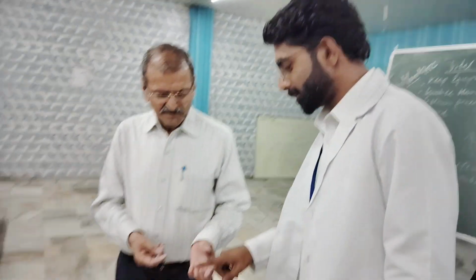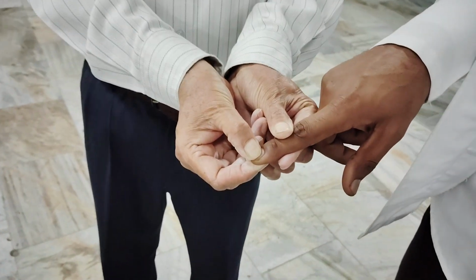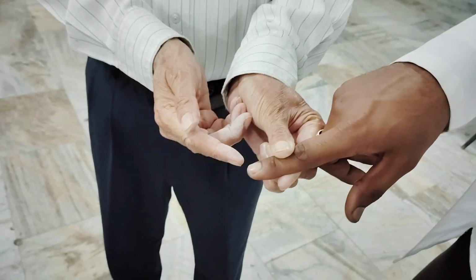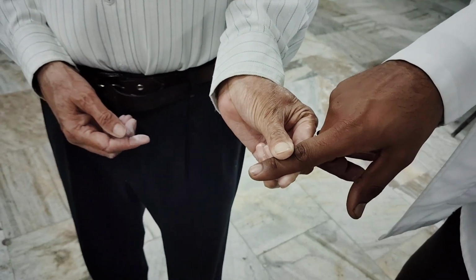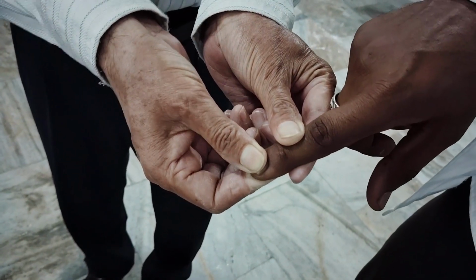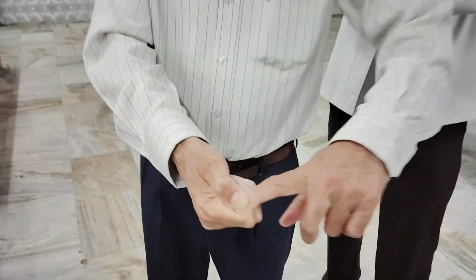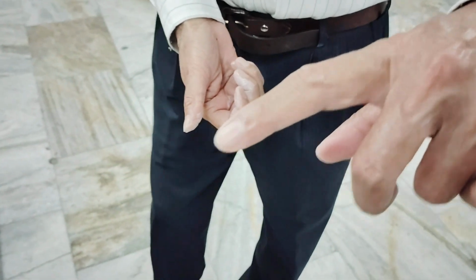We will press on the nail bed for 3, 2, 1. Now immediately it has got refilled after the procedure, right? First it will get blanched and then it will get refilled. You can try on your own hand also, right? 3, 2, 1, it will get blanched and immediately it will get refilled.